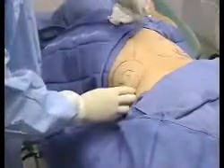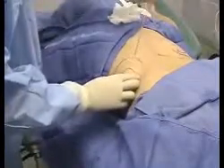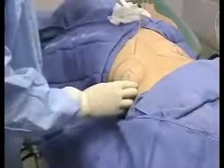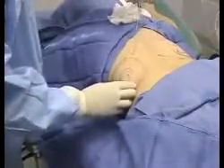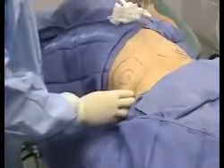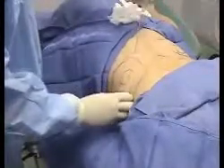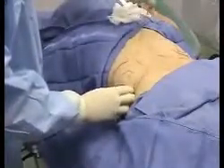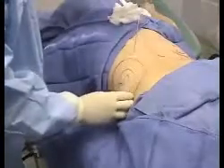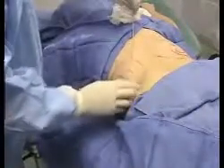And just like the internal ultrasound, when you first start pushing it through, especially a fibrous area like this, or gynecomastia in a man, it's a little bit hard to get it through. There's a little resistance, and after a while, it's just like moving a hot knife through butter. There's almost no resistance because the fat has shrunk, and the little fibrous septa are all that's left. And we'll talk about those fibrous septa and what I think happens to them with this technique later.